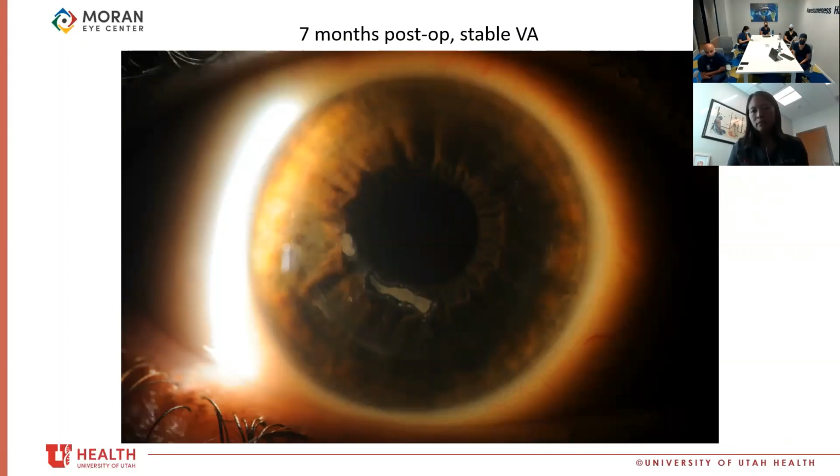We have a question. Do you think mitomycin application could have made a difference in the outcome of the epithelial ingrowth? Yeah, so I had read some articles about mitomycin. I was just a little hesitant in using mitomycin within a LASIK flap. I wasn't sure, so I decided not to, but I think I could have tried it. It may have helped kill off all the epithelial cells in there, but I didn't want to end up with any sort of necrosis later on, or, who knows, with mitomycin.